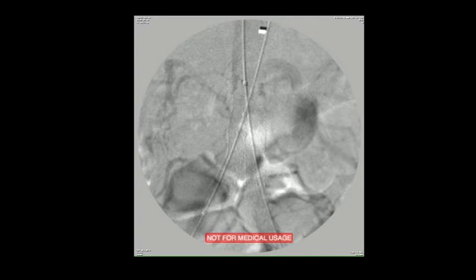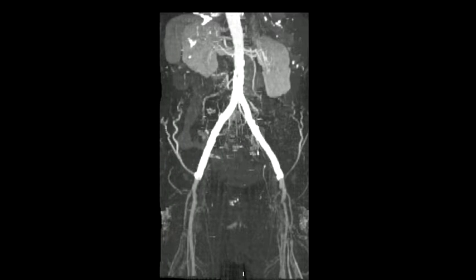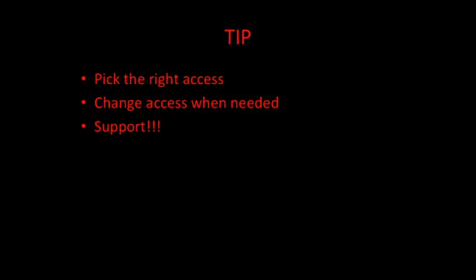This is to illustrate some points. This is the CT extend from the infrarenal aorta. The right axis for the lesion that you want to cross. It must be understood clearly that the job we do is a mechanical job. So the straighter the path you can get to the tip of the wire, the more weight, the more load, the more force you can transmit to the tip of the wire, which directly impacts what you can cross.